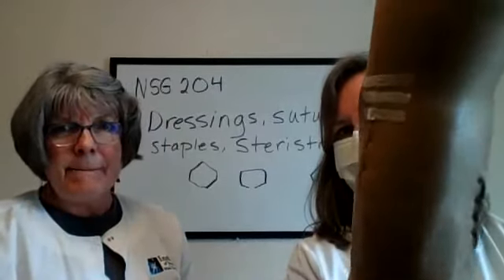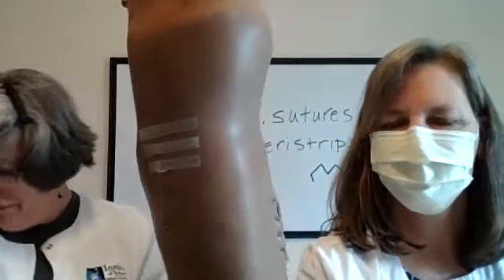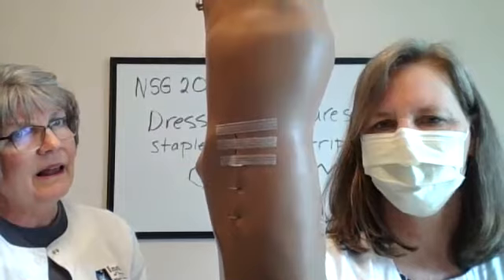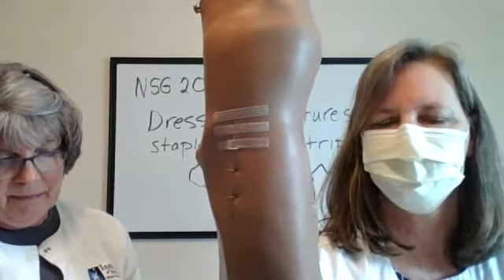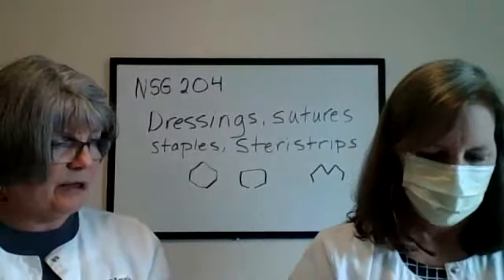Education of the client for removal of Steristrips. They don't remove them. They wait. When you have Steristrips, they usually put Mastisol over them or maybe not, but they can shower with them usually after a couple of days. And then they start to curl at the ends. And then what you tell them is to cut those curled ends off, but do not rip the Steristrip off. It will naturally wear off. Absolutely.